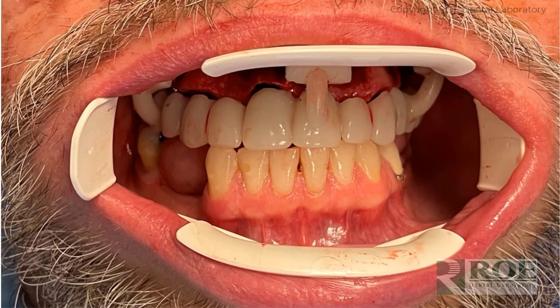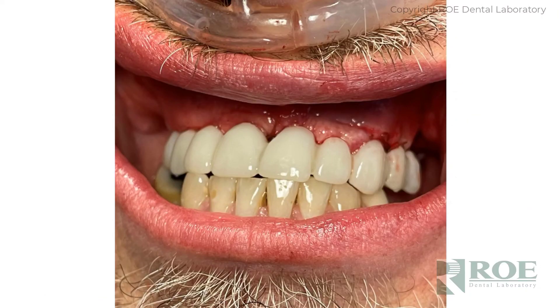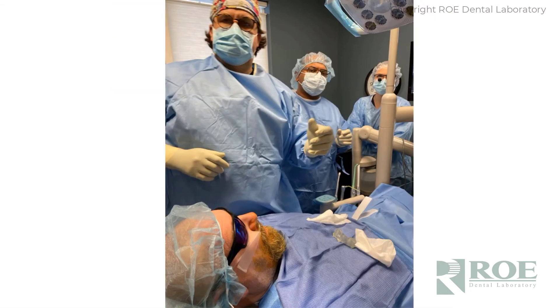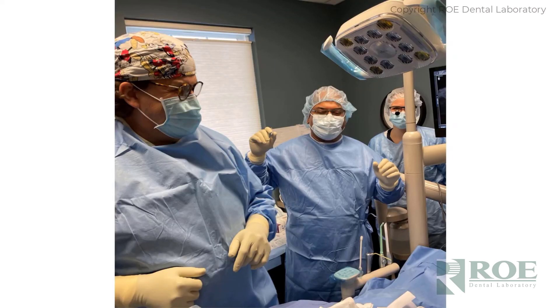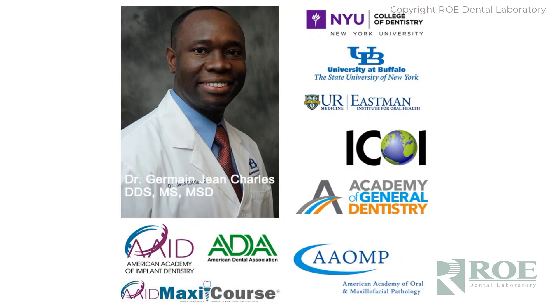Just going through some more images here — the process: seating, loading, picking up, suturing, and then delivery. That is an FP1 prosthetic, which allows the patient to have bone for years to come as opposed to leveling the bone down for an FP3 or FP2 design. Thank you very much to the doctor for sharing these images. Always be aware and attentive during surgery, watch out for stuff hitting the floor, and always have fun. Thank you, Dr. Charles, for being a great partner and for sharing your surgeries with us.